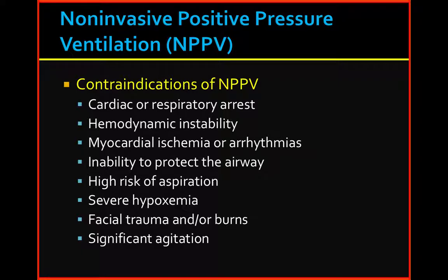Okay, so what's the purpose of this ventilator? The purpose of the ventilator is to maintain homeostasis between the two gas concentrations that we're talking about here, which is carbon dioxide and oxygen. Oxygen is being put into the patient and carbon dioxide is coming out. And for the most part, we want to keep those close to normal. There's some exceptions to that.